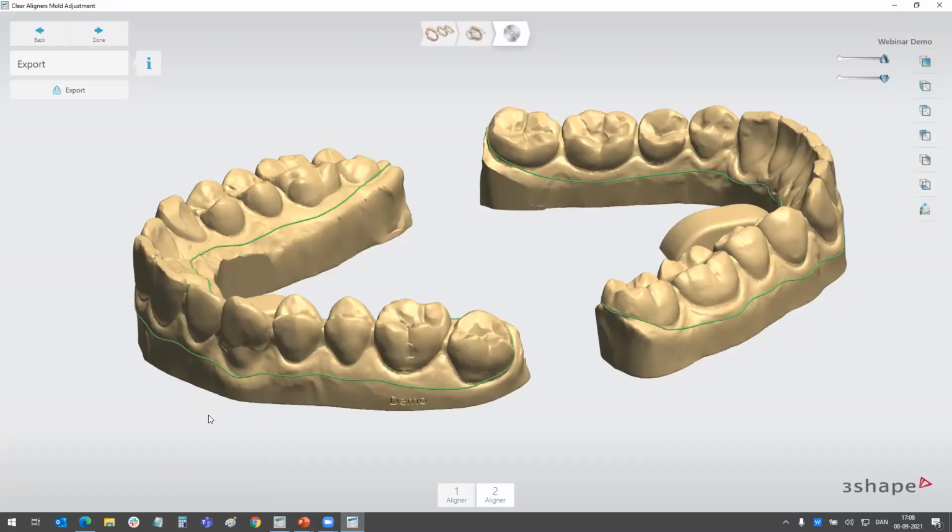We need to make sure that we respect all the HIPAA compliance and patient data safety rules. When people make a real account, we make sure that they know where the data is, and we also have the official handshake between the clinic and the lab, that the lab is in fact allowed to receive this patient data. That needs to be in place, so that's why they need to make an account for this.